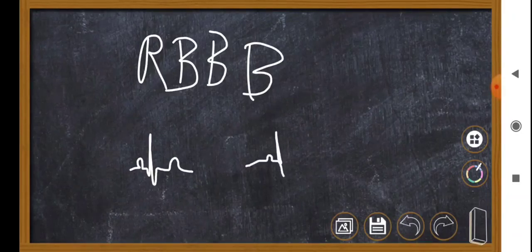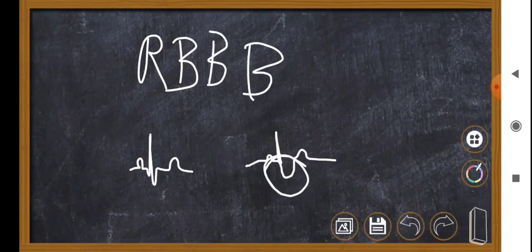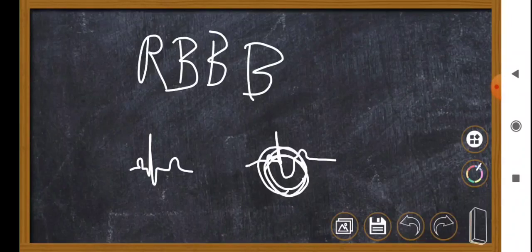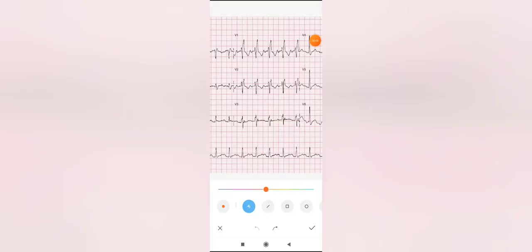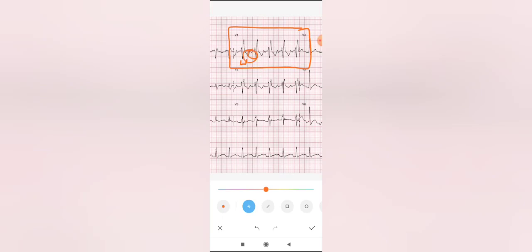The slurred S wave in lateral leads is often confused with ST depression, but it is actually a slurred upstroke of the S wave. Here is a 12-lead ECG showing right bundle branch block. Focus on V1: QRS is more than 120 milliseconds, secondary T wave inversion is present, and the RSR' pattern is visible — not seen in a normal ECG.